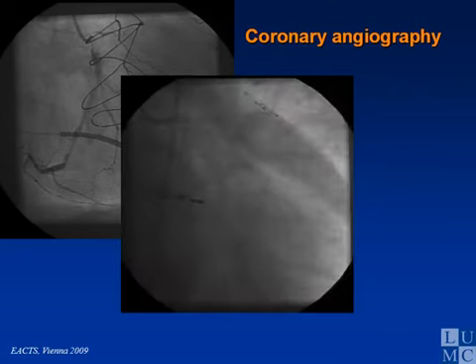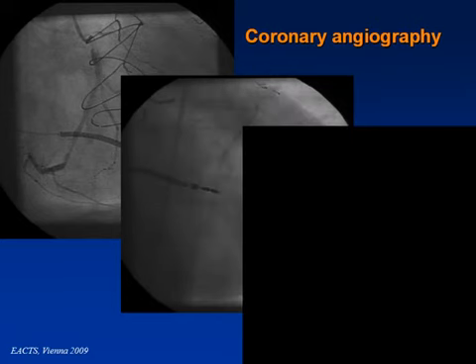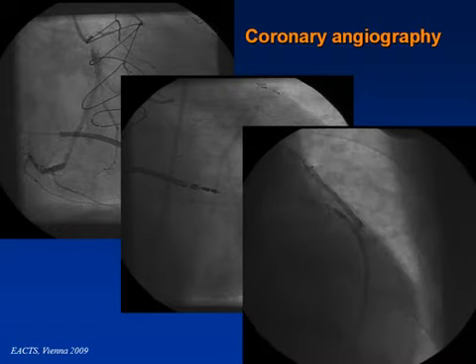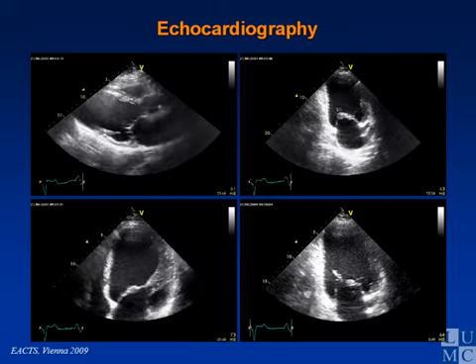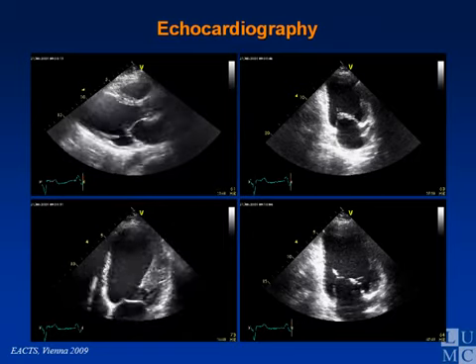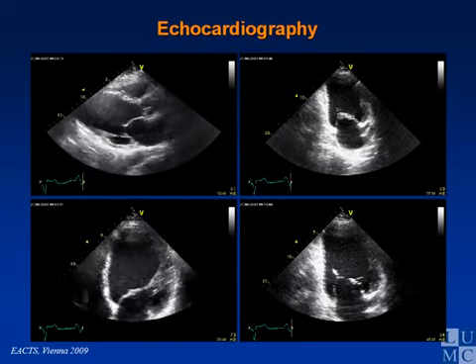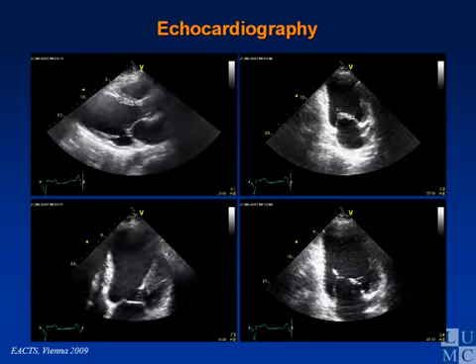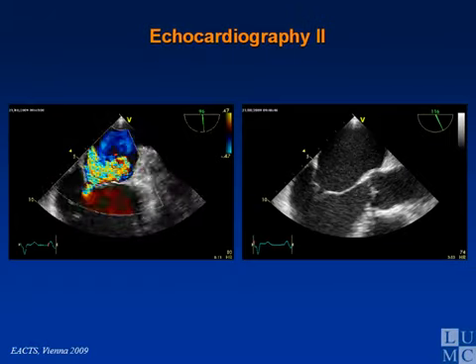He had the right coronary artery, left system with a patent vein graft between these branches, but it was occluded to the aorta, and his LIMA to LAD was patent. I hope you can see that with this light. His echo. There are still some basal segments contracting here. This is hypokinetic posterior wall, large akinetic apex. I think part of the septum is still working, but part is scarred. And these are not moving, but I assume you can see the problem of this patient.